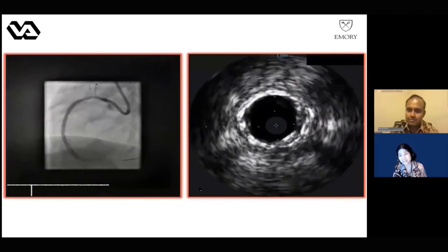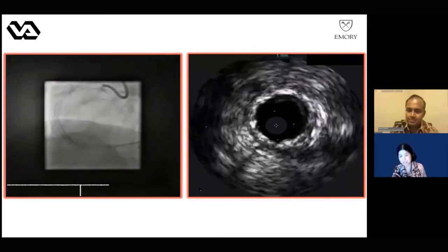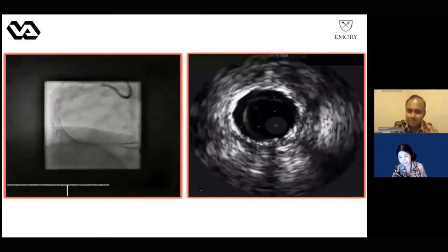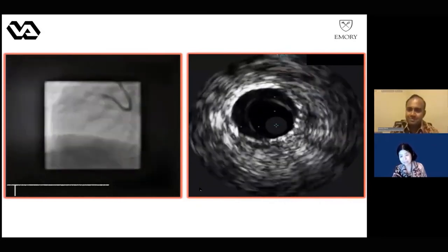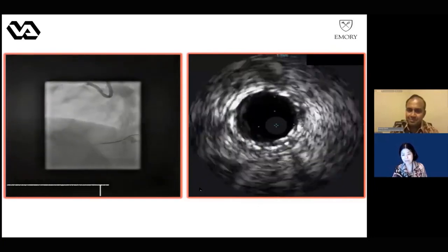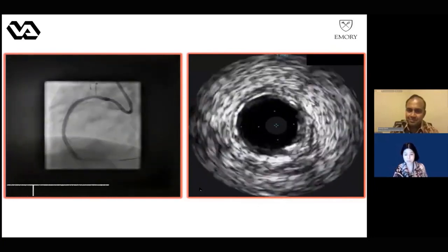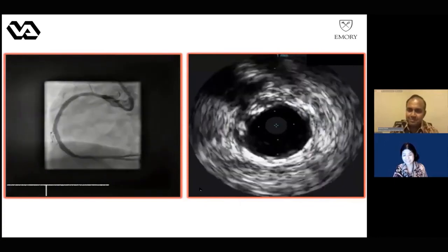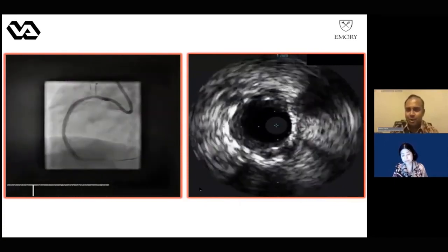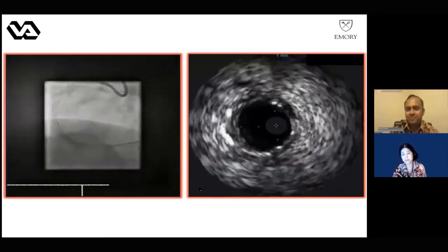You see the stent was super underexpanded. This is the place where we saw the severe underexpansion. You remember the double layer of the strut and also the calcium behind. And now it is almost over 7-8 square millimeters, wow. So we have done well there. I think there is not much to explain. It's just good expansion.